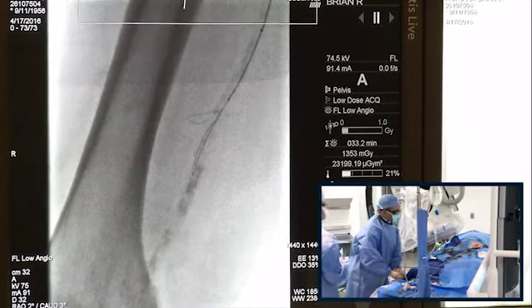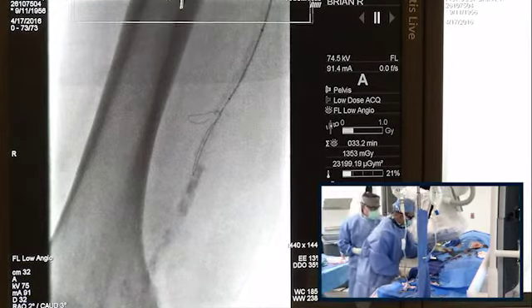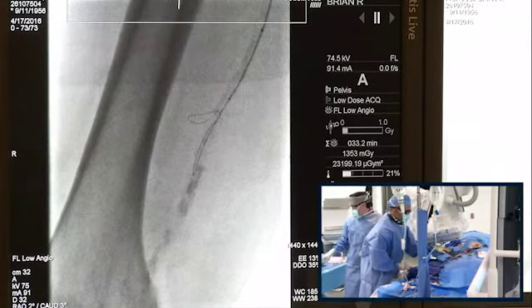So, Mehdi, you mentioned an ACT. There are differing approaches, it seems to me, mostly based on the specialty of the operator. Do you have any feelings about heparinization or what's the appropriate anticoagulation for these types of cases? So we are right now with heparin. Can you go back in? Go in, push it in. Can you turn this monitor's level so that Goodman can see?